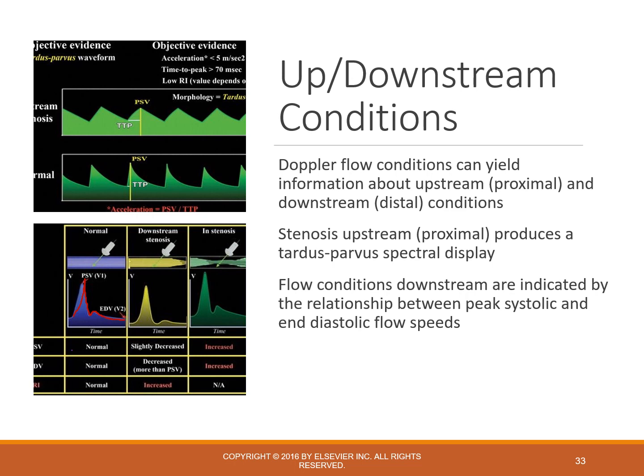Now, if there's a stenosis downstream and it's not able to move blood flow through, it's going to almost act like an arterial constriction. It's going to increase the resistance to the blood coming into it. So here you still see good systolic upstroke, but the forward motion is reduced in early diastole. In late diastole, the Windkessel effect is still strong enough to push it through.